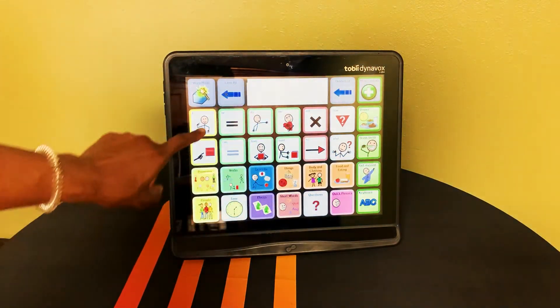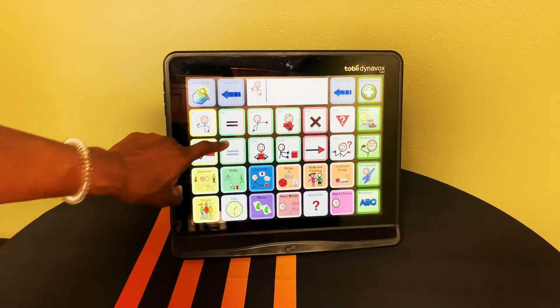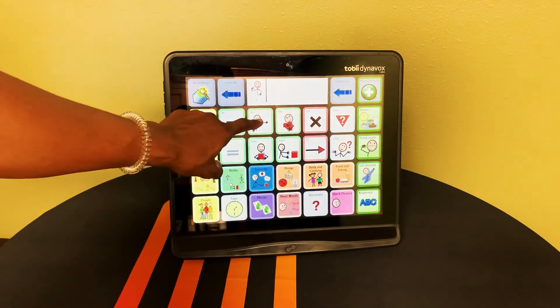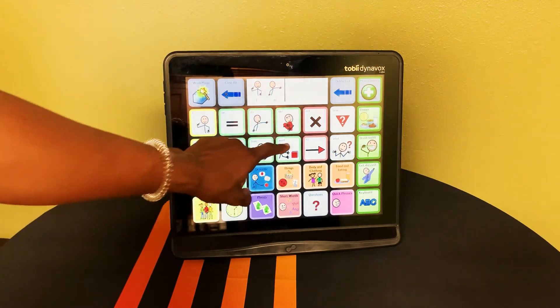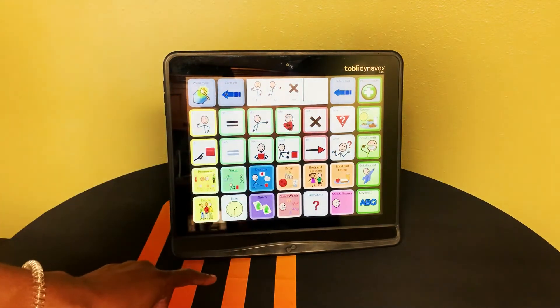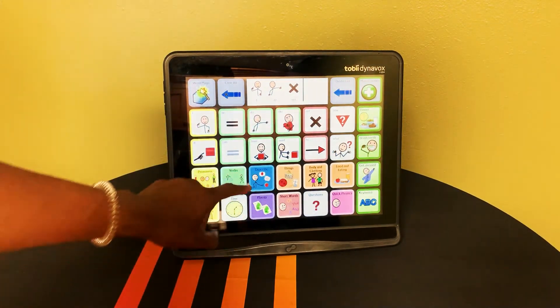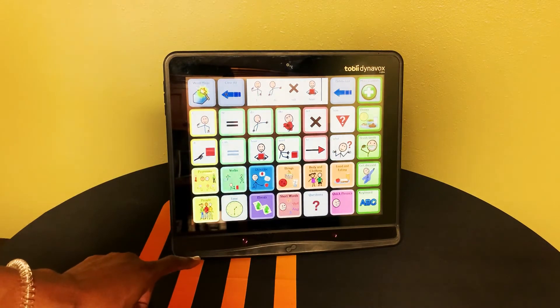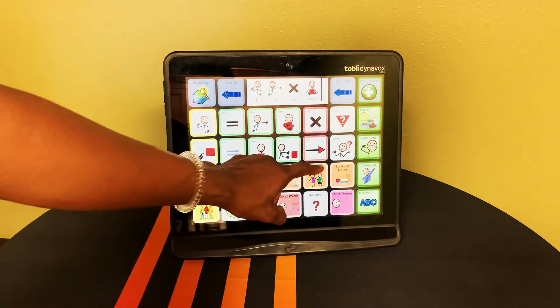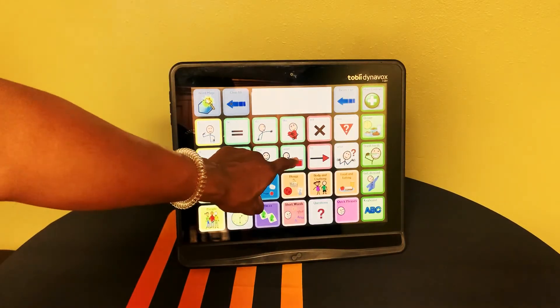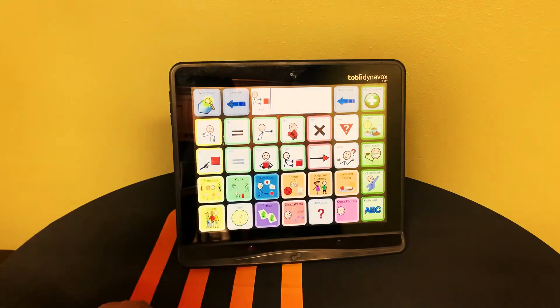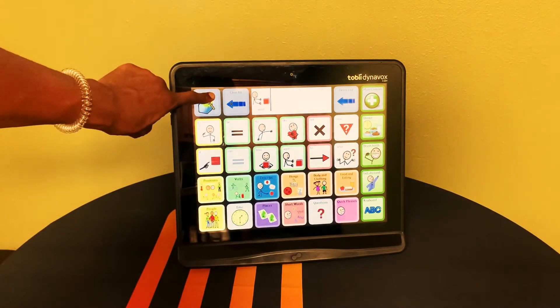Here we have Communicator 5, which will allow users to type out complete sentences either using the quick phrases or the full keyboard that comes included, or even using the magic word option in the corner. The magic word option will give you different versions of words such as want or wanted.